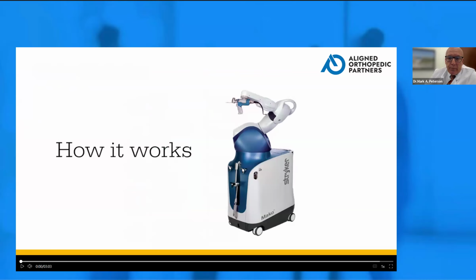And here is a little picture of the machine. When people talk about robotic surgery, I tell people it's really computer aligned surgery. It's not a robot that goes in and does it. It's kind of like the self-driving cars. It's a haptic controlled saw blade that is predetermined. You make all the alignment decisions for your cuts prior to the robotic arm coming in, and then this guides you and protects you from making an abnormal cut or an abnormal angle to your saw cuts.